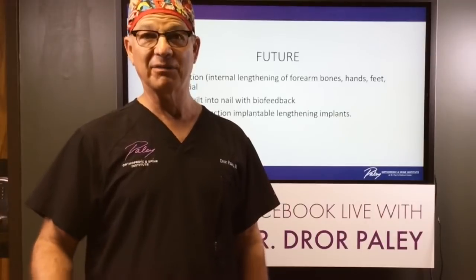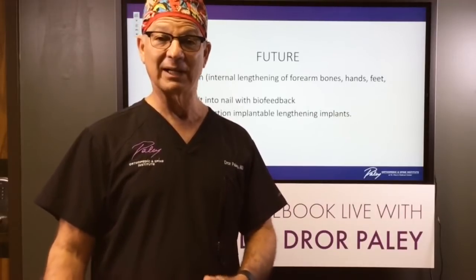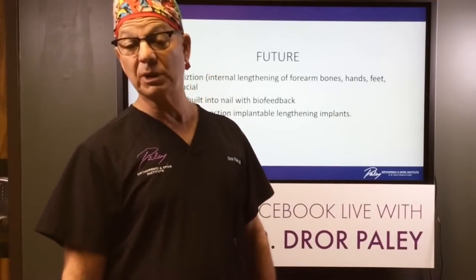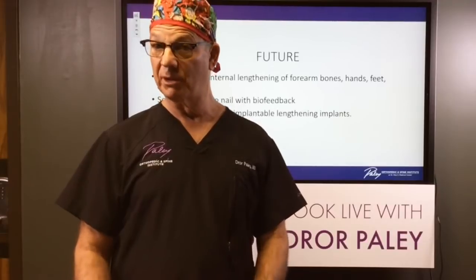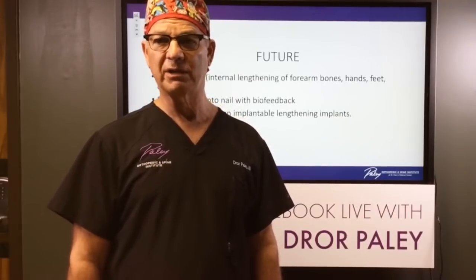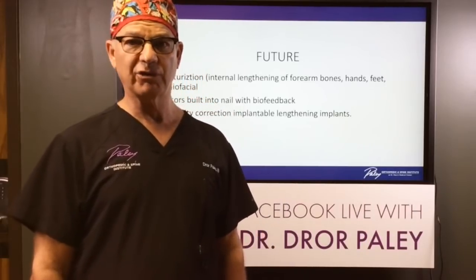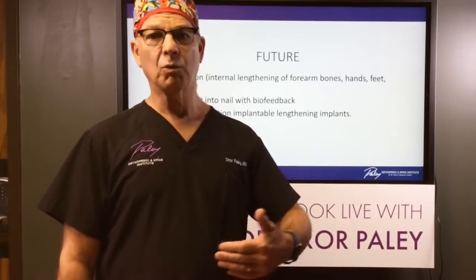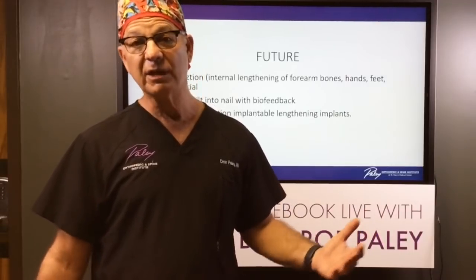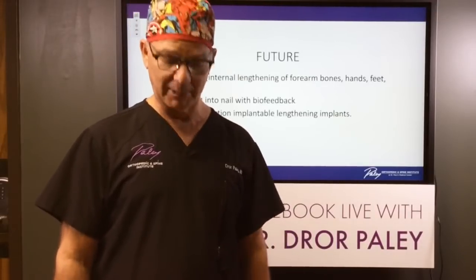The implantable devices have a fixed length, or a minimum length, and they also have a certain thickness. And so you have to be able to accommodate that length and thickness either on the surface of the bone, or even more constrained is if you're trying to put it into the center of the bone. So our current devices are still not fully miniaturized. Okay, they're kind of designed for the majority of big bones, but they're not yet designed for a 1 or 2 year old unless their bones happen to be unusually good size.